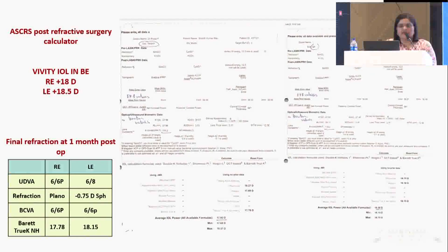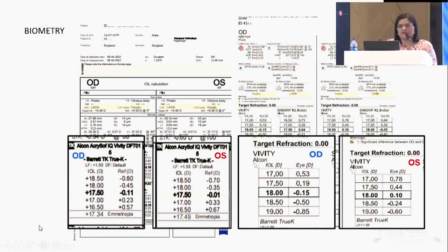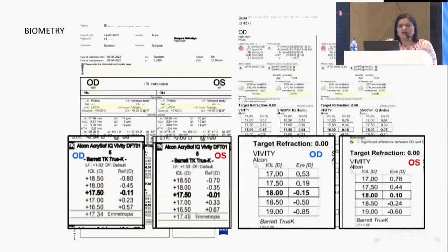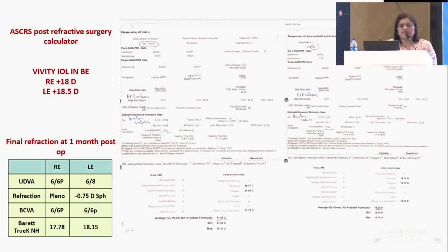Now Barrett True-K, no history formula had suggested something like 17.78 for the right eye and 18.15 for the left eye. So you can see that the difference between these three formulas, be it the previous one, these two and the next two, are very, very close by. But what is actually giving 6/6 is probably something closer to the formulas which are closer to Barrett True-K. And as compared to that, in the left eye, when the slightly higher power IOL was added, plus 18.5, we got a minus 0.75 diopter spherical as residue.